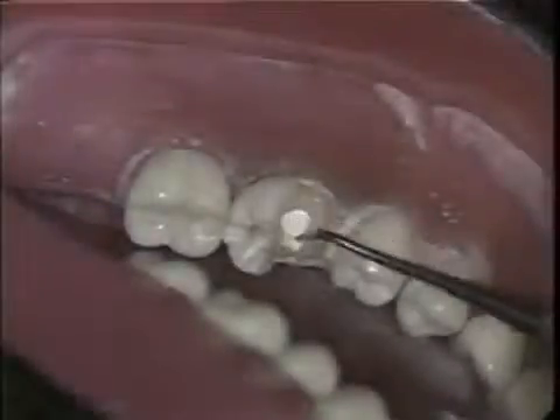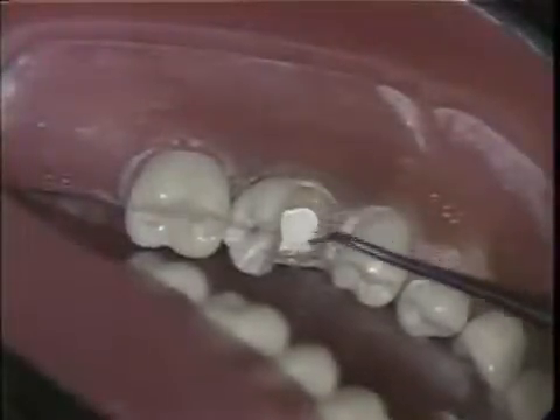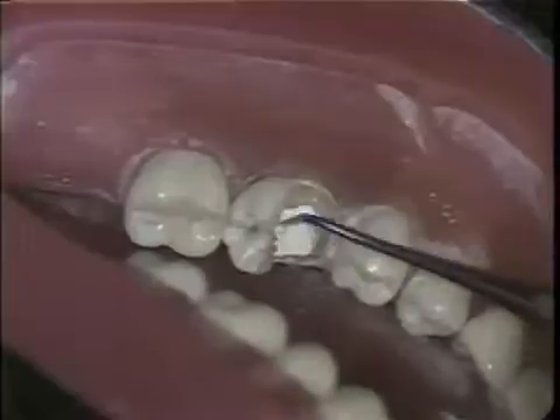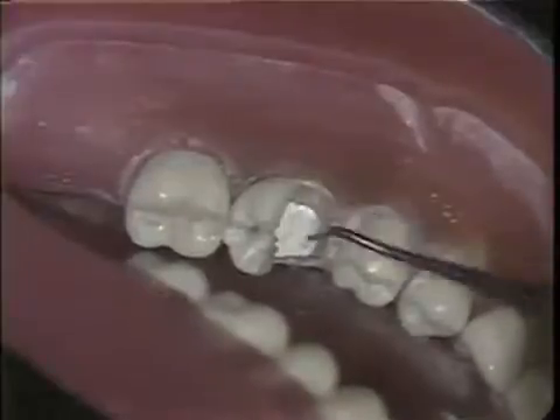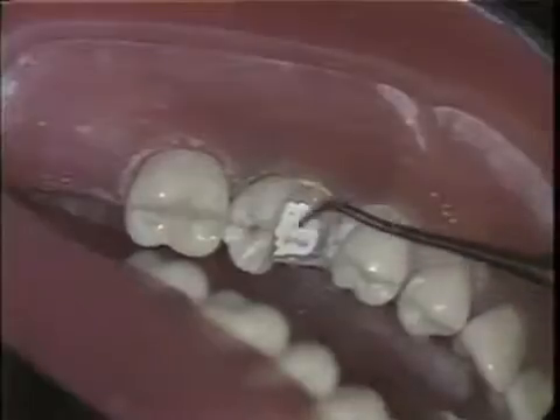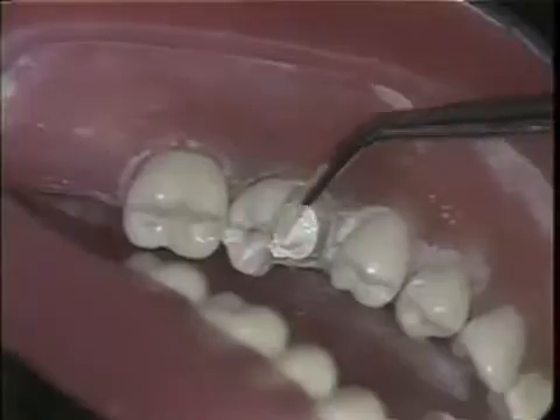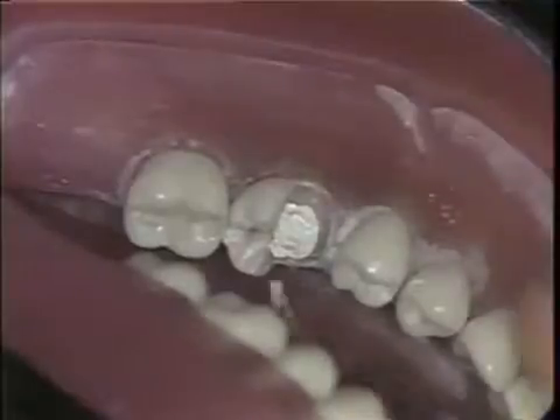The next step is to place pulpal medication. A thin layer of calcium hydroxide liner is placed over the pulpal floor and the deep areas of the cavity. This is followed by a thin layer of varnish, which is also placed on the dentin.